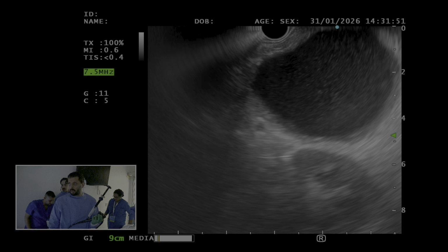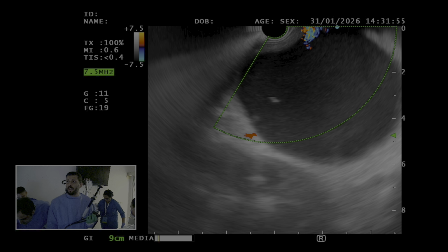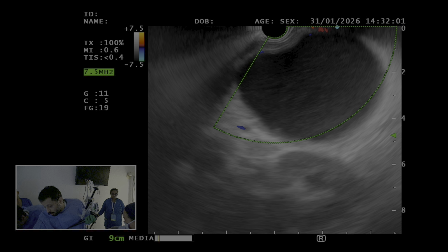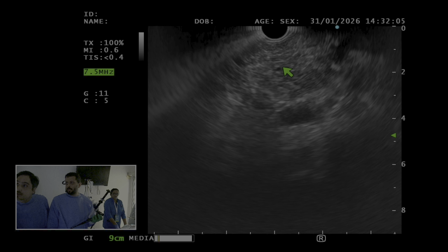All right. So here you can see, you guys, the axis here. There's no pancreatic parenchyma. There's just some artifact. Where's the other cursor? So you want to show them the PD? Here's the pancreatic. Okay, so this is the PD here.